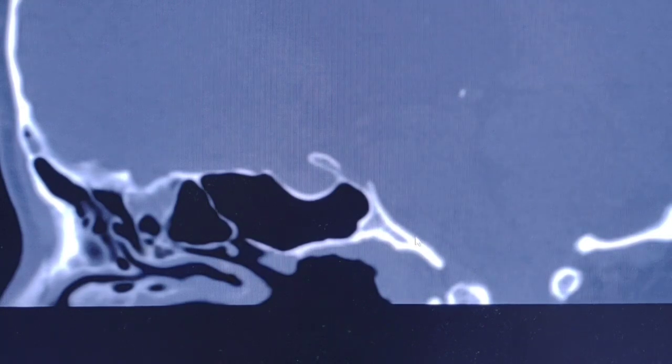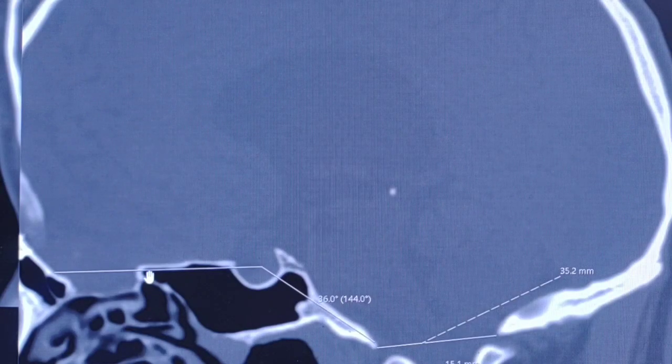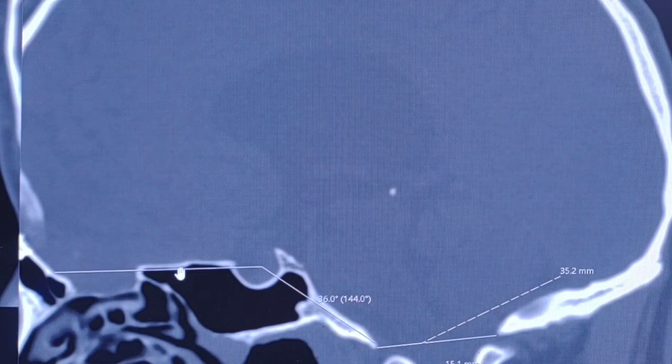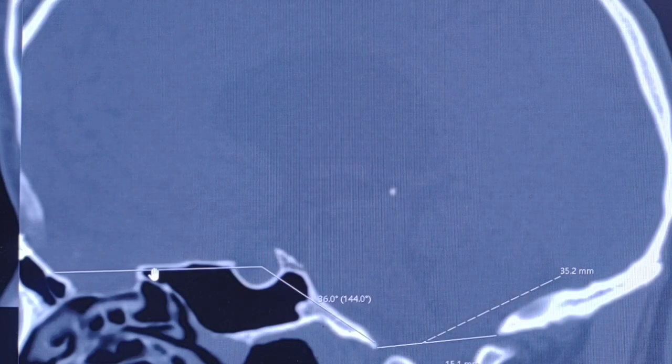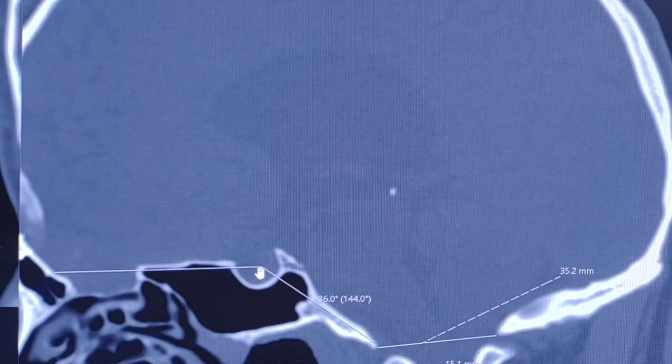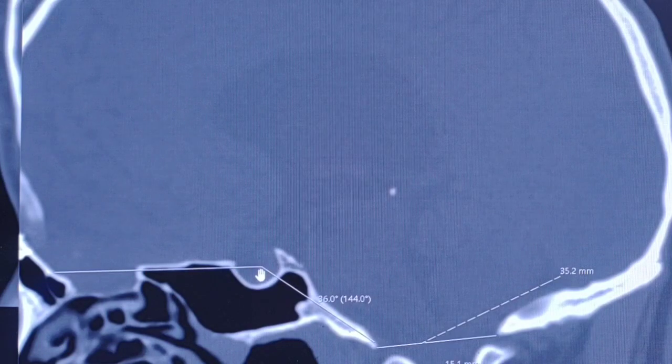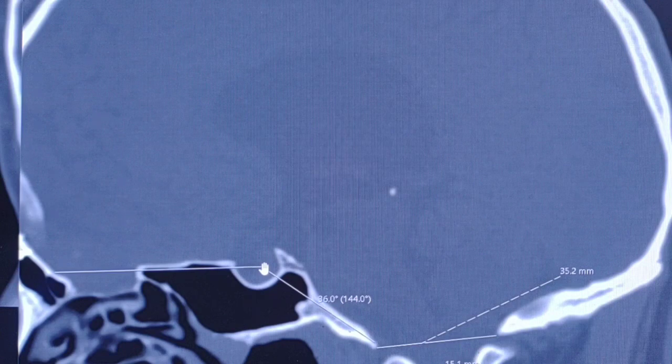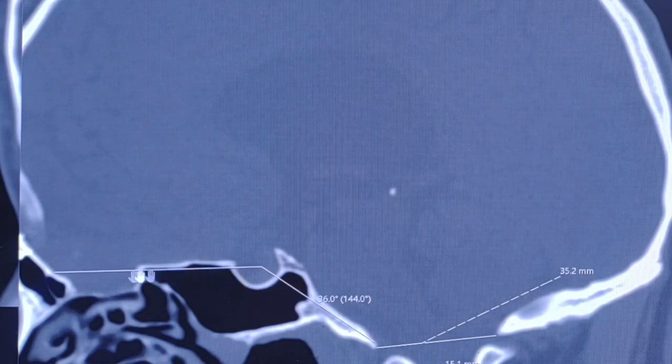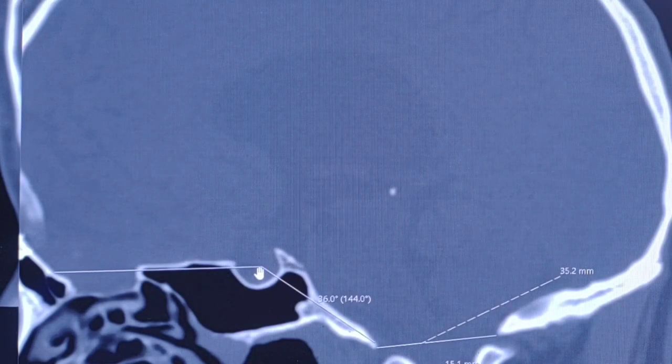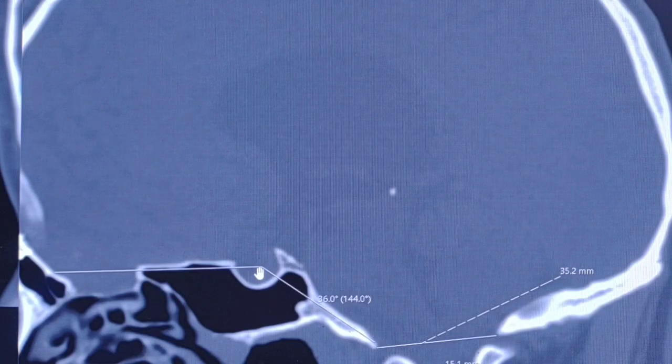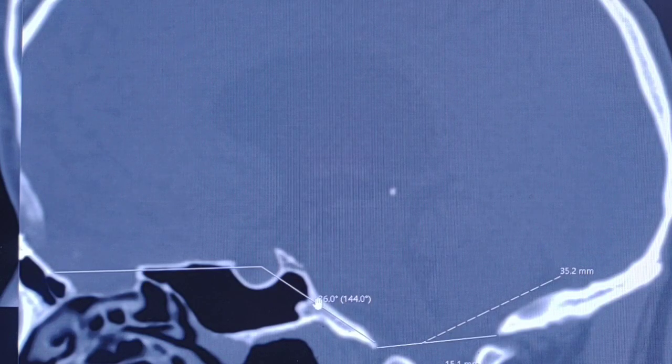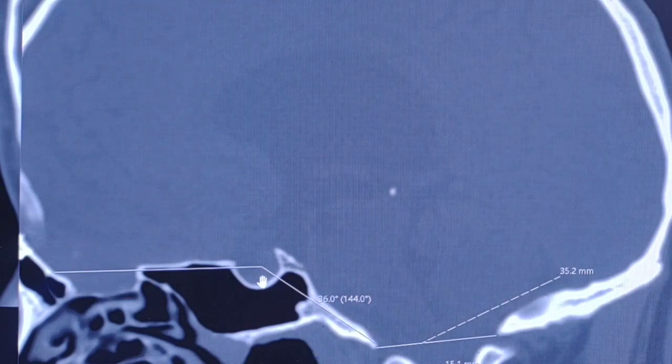So platybasia is the abnormal flattening of the skull base. How we measure it, I will show you right away. We try to find the angle formed by a line passing parallel to the floor of the anterior cranial fossa and the line joining the center of the pituitary fossa up to the anterior border of the foramen magnum here. This angle should normally be between 125 to 143 degrees. In this case, it's 144 degrees. So this is platybasia, abnormal flattening of the skull base.